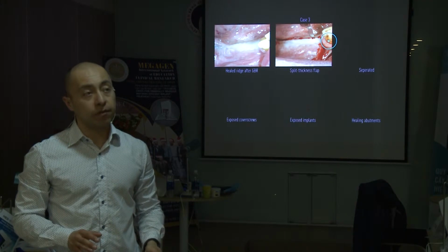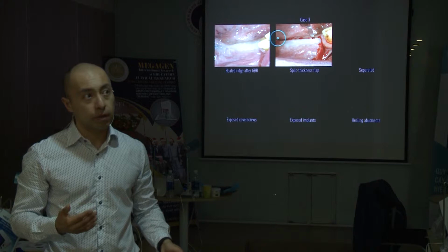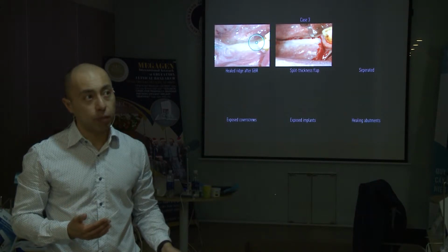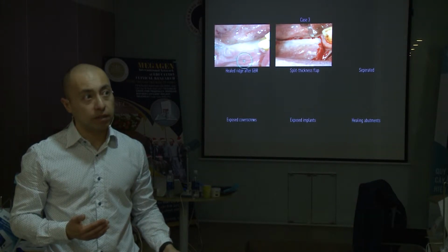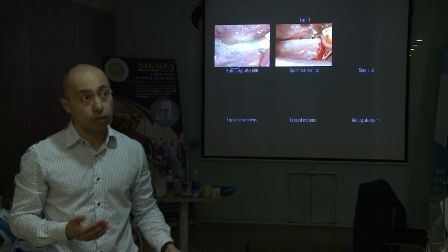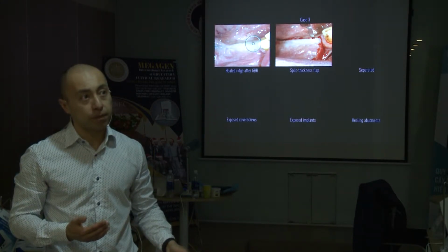If you make a full flap, you will destroy the amount of keratinized tissue. So this white here, this is the keratinized part. This is non-keratinized. This is mucosa. This is soft. This will hurt the patient. So it's my job to increase the width of that keratinized tissue.